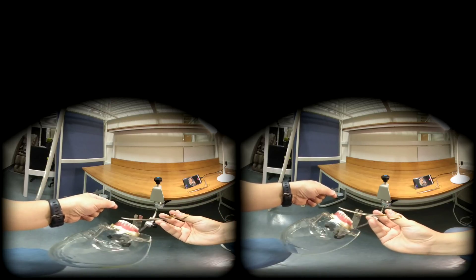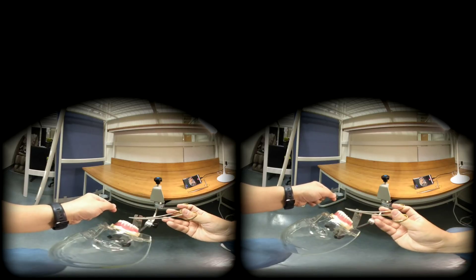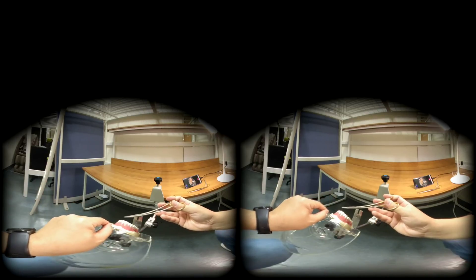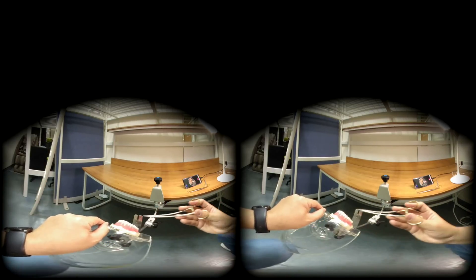Rule number two: rotate the silk around with the needle holder inside the loop. This is the short end, this is the long end, and they make a loop — a complete circle. When you create a circle, the needle holder goes inside, not outside.